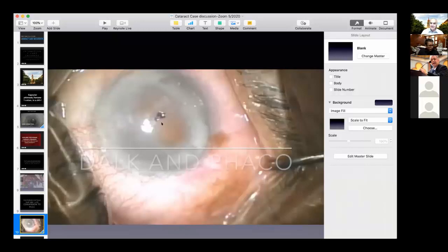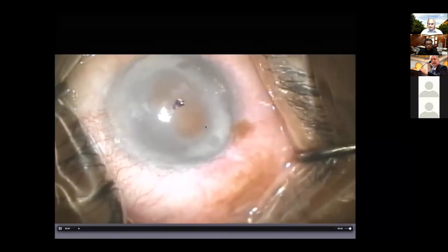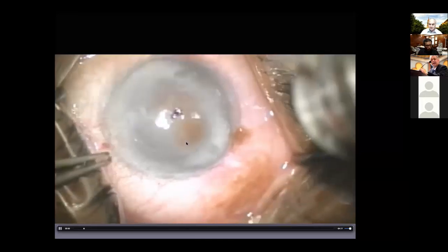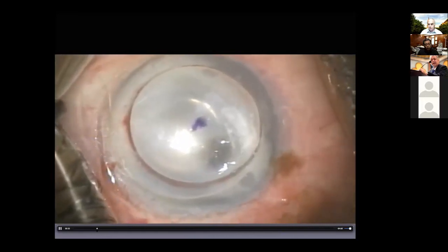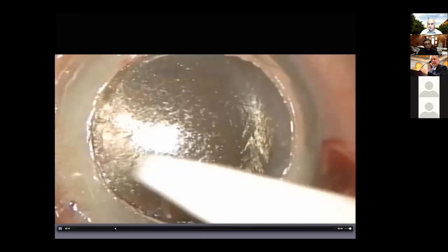And in this case, this is a stromal opacity, essentially. It's not reaching the endothelium. So I decided that I will prepare a lamellar graft. I will do DALK, and I'll see if it is possible to continue on the plane of this membrane and do Descemet's layer or not. And it's preferable, as you can see, I'm trying to do the DALK, injecting the big bubble, not perfect, but still I can do the dissection.